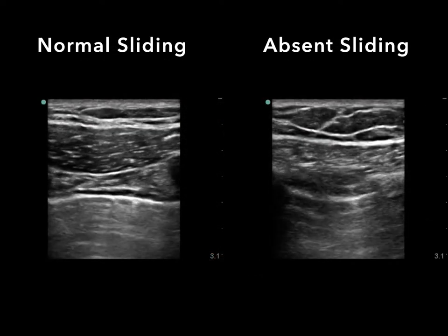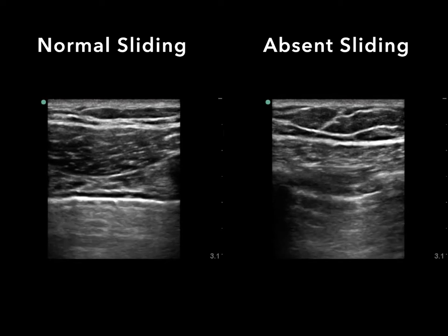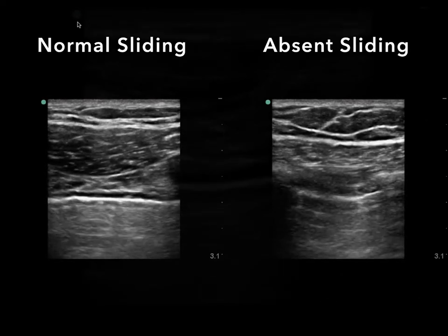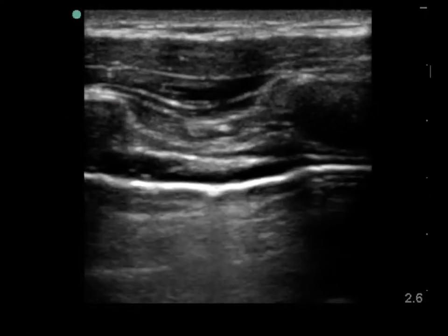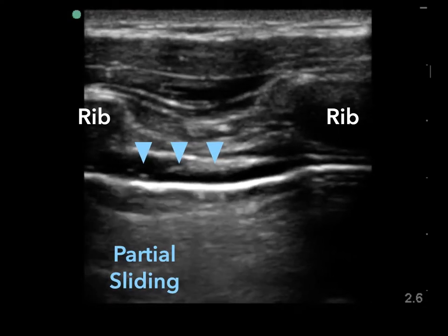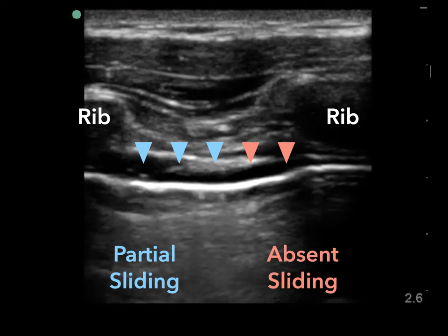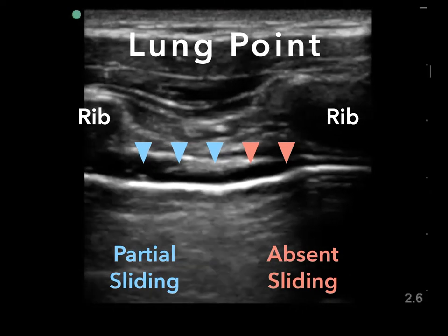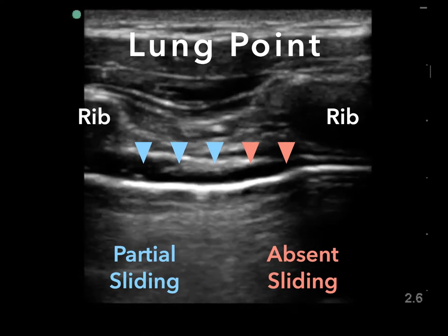It's easy to see the difference when you compare normal sliding and absent sliding side by side. You may occasionally see the presence of partial sliding in the pleural line adjacent to a portion that is not sliding. This is called the lung point and is the most specific ultrasound finding of a pneumothorax — essentially the spot where the visceral and parietal pleura separate from each other, where the pneumothorax starts.